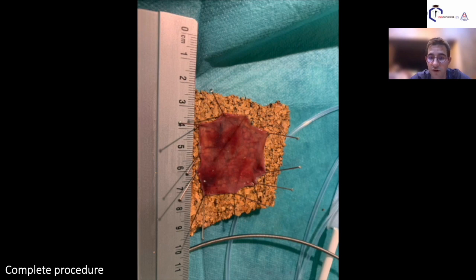completely removed, R0 on the vertical and horizontal margin, and it means a curative resection, totally curative, with a next control of colonoscopy in 3 years in French guidelines, and in between 1 and 3 years depending on international guidelines.